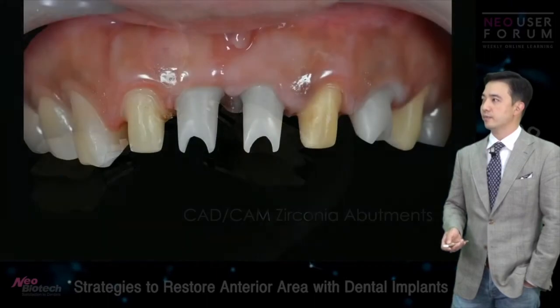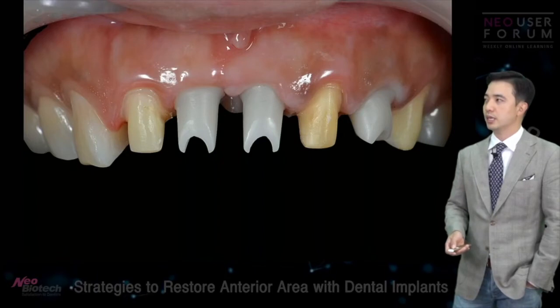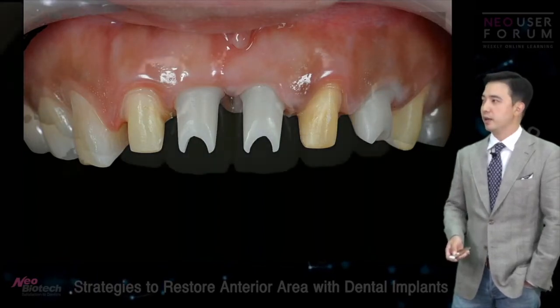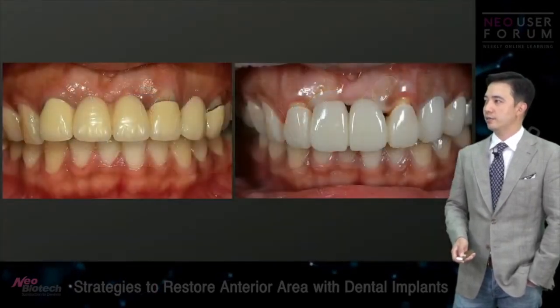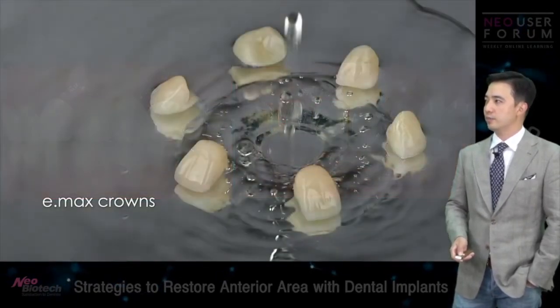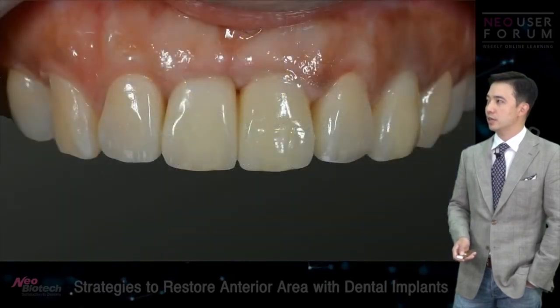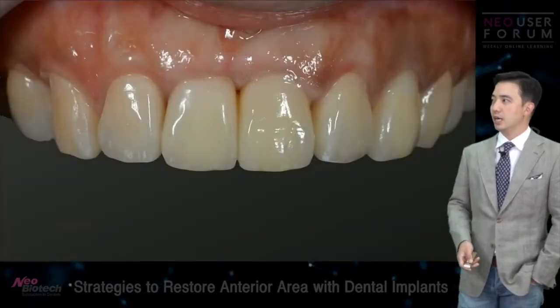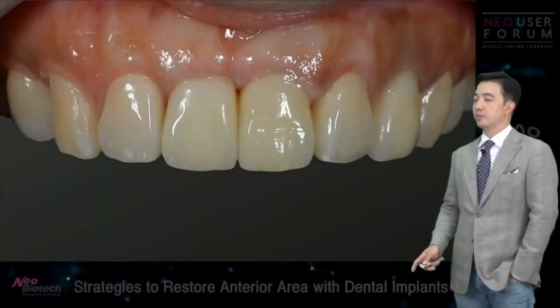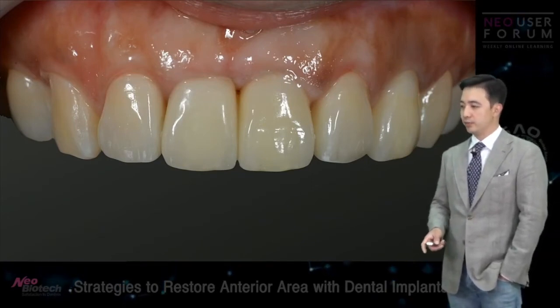So after putting in the zirconia abutments, I just tried to put PMMA provisional restorations on top of it, okay? And finally, after waiting a couple weeks, I think we waited for 2 weeks, we went ahead, placed the Emax crowns on it, and this is how I got the papilla for the final result. So, I mean, it's not perfect, far from being perfect, but at least it got better than the provisional restoration.